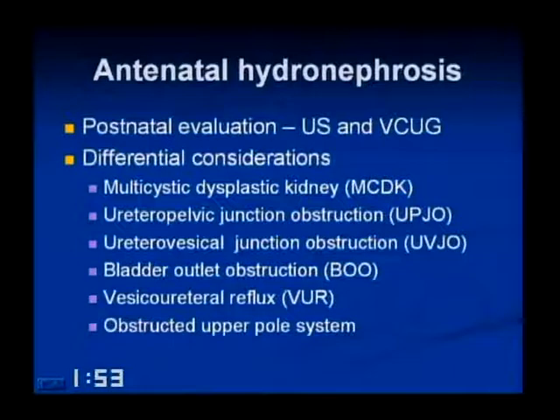I'm sure you've had time to read about the differential diagnosis or considerations in antenatal hydronephrosis. Prenatal sonography is very, very good. However, we don't always have the diagnosis. That's why we have to perform imaging after birth.